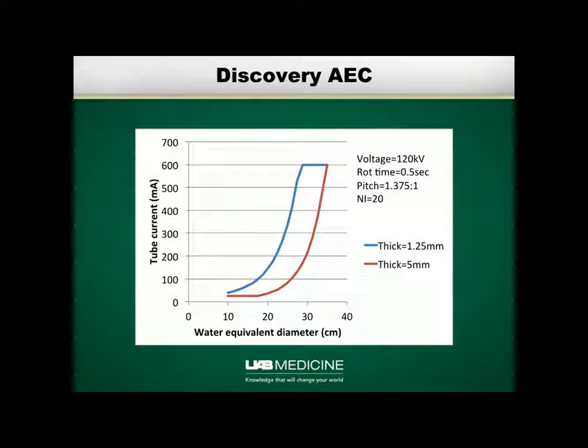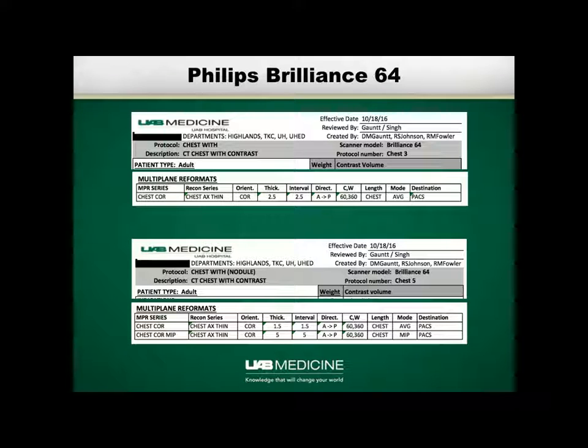Well, then you've got the GE Optima, where that's true, but there's an additional parameter that you can set called the dose reduction, which tells you how much you want to reduce the dose by after this calculation. And then on the GE Revolution, it doesn't have a dose reduction setting, but it will change the curve based on what the ASiR level is, where ASiR is GE's noise reduction algorithm.